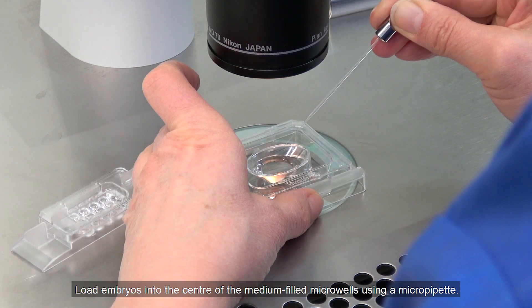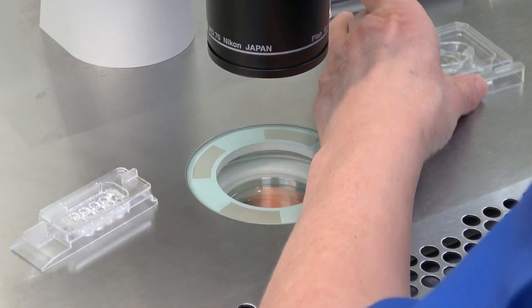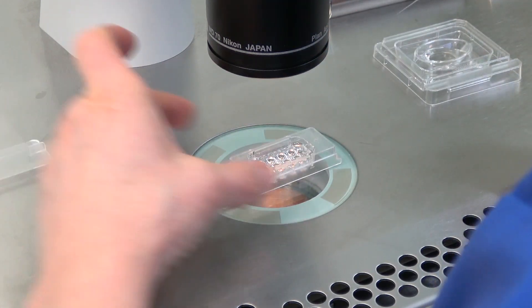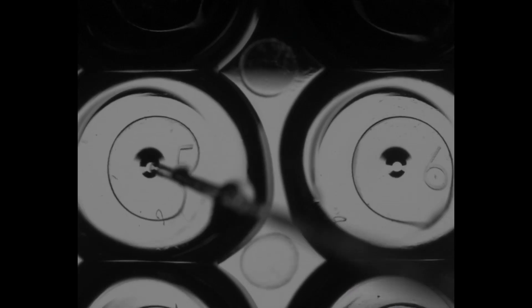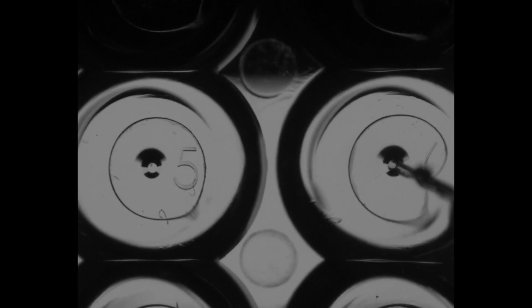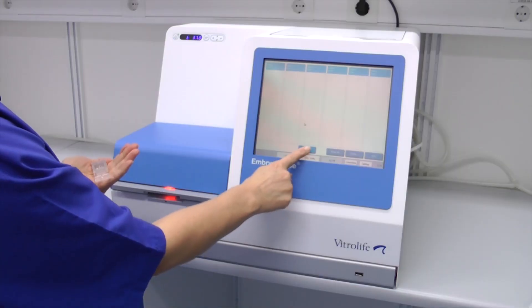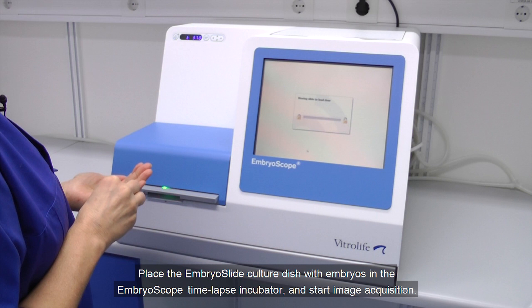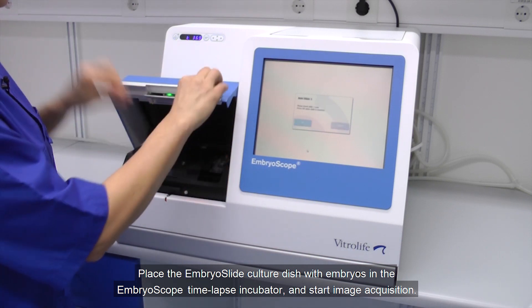Load embryos in the centre of the media-filled microwells using a micropipet. Place the embryo slide culture dish with embryos in the EmbryoScope time-lapse incubator and start image acquisition.